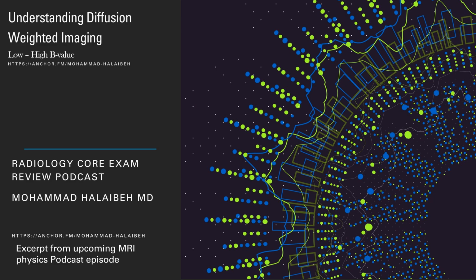Now, another concept that we didn't go into too much detail is the b-value. Diffusion weighted images are typically obtained at two b-values, one low and one high. What is b-value? B-value basically determines the amount of signal loss due to Brownian motion. The higher the b-value, the more signal is ignored due to self-diffusion or due to random motion.